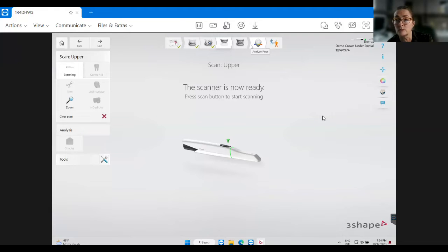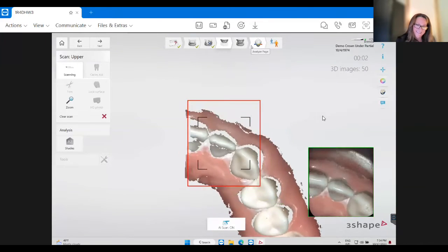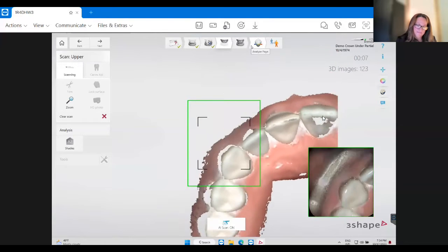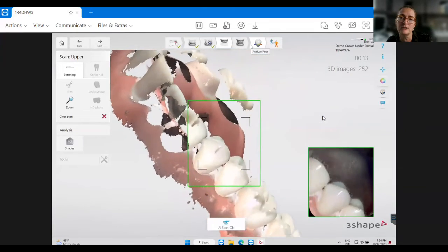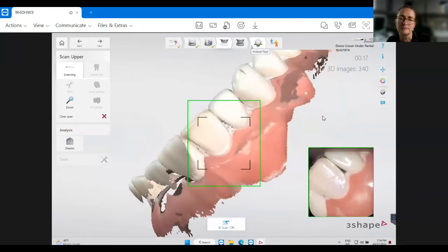Nice prep for a Dremel tool, Brenda. It was like, can I find a smaller burr? I've over prepped, but you know, and I have a double margin in a couple little areas. And please, any questions that are coming to mind, feel free to jot them into the Q&A or chat box.